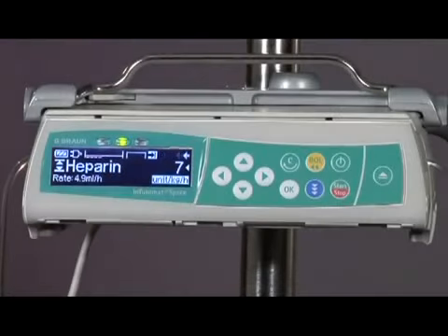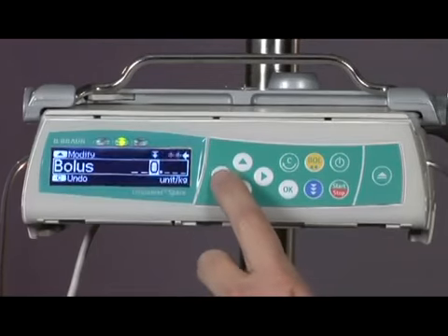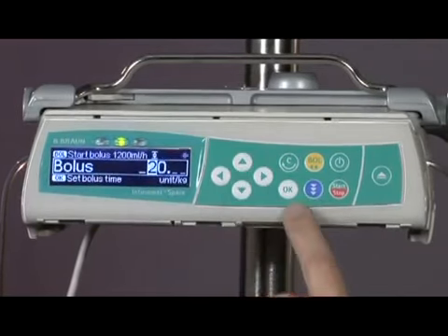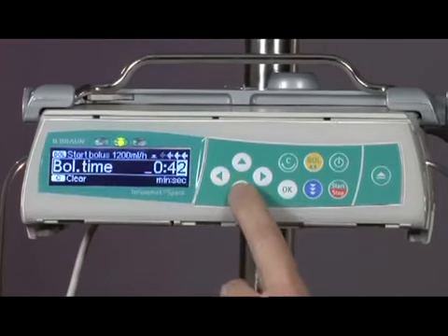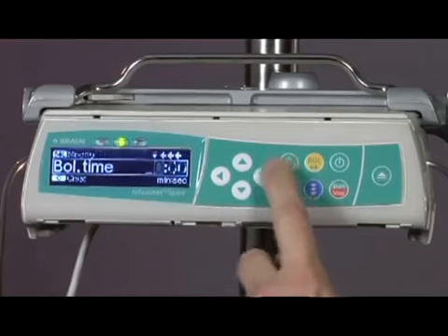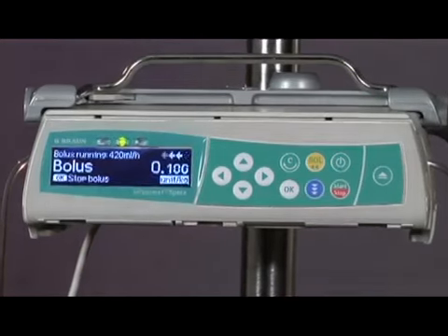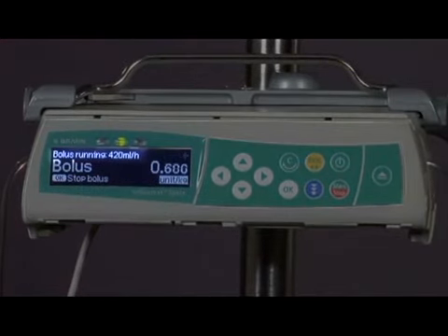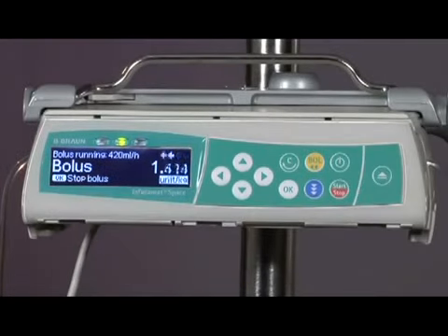Now we will program another bolus and add a defined time to the bolus infusion. First, press the yellow BOL button. Press the left arrow button and set the bolus amount using arrow buttons — enter 20 units per kilogram. Press OK to set bolus time. Clear the values and enter 2 minutes. Press the BOL button to start the bolus infusion. The rate is now running at 420 mils per hour to deliver the dose in 2 minutes. To cancel a bolus infusion, press OK or any key during the bolus infusion.